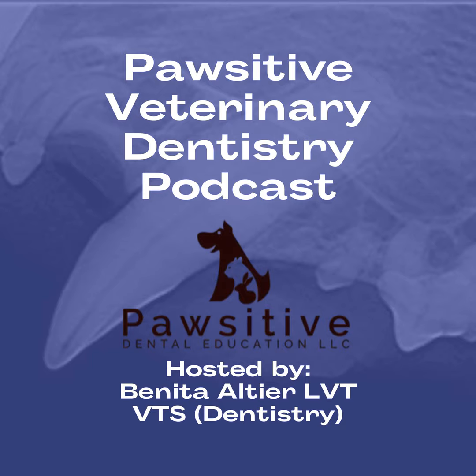And then stage 5 is the ones in which Mother Nature pretty much did the job for us. You just have a hump of tissue with maybe a little bit more bone there than what you would normally want to see, but it's healed up, and radiographically you just see some hints of what I like to call ghost roots, where there's no real inflammatory component that you see obviously, but you see where there should have been a tooth and there no longer is a tooth, but all the bone and gingiva looks healed up over the top of it.